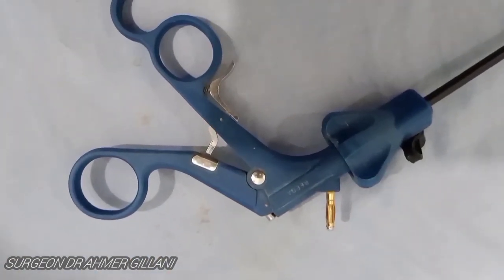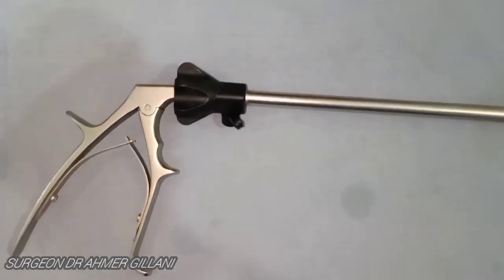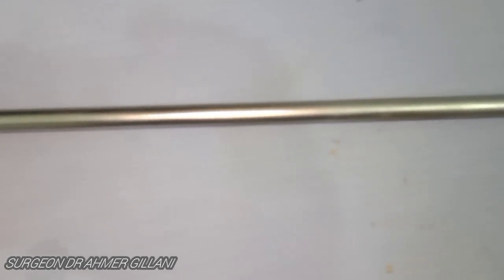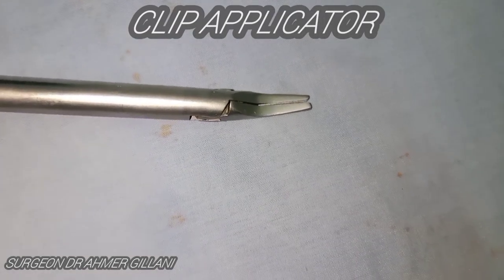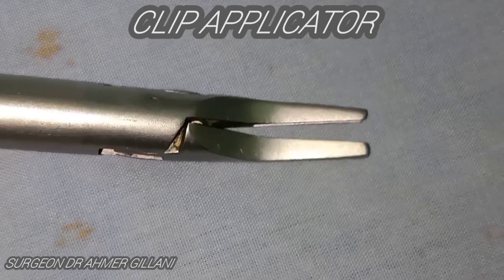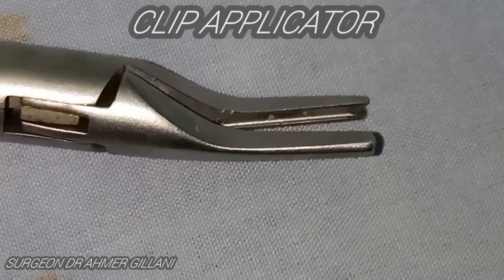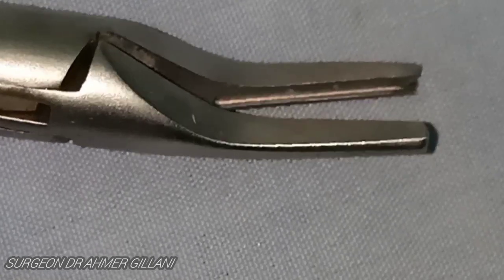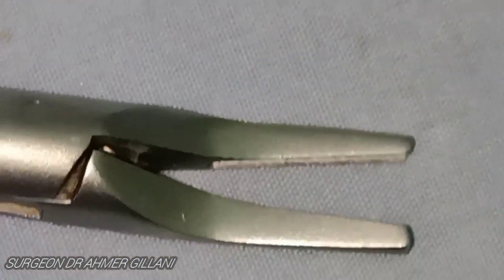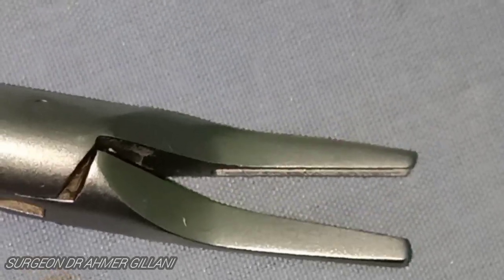The next instrument on your screen is known as the clip applicator. This is the final view of the clip applicator and its edges. It is used to apply clips in case of laparoscopic cholecystectomy, laparoscopic appendectomy, or in any surgery when you need to apply clips.